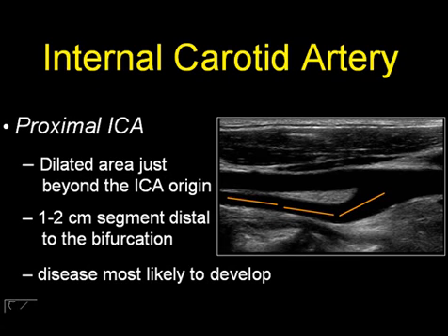Now, once you've determined which vessels you're looking at, we would then carry the examination out through the proximal, mid, and distal portions of the internal carotid artery. And in our facility, we have strict definitions about determining the portions of the internal carotid artery.